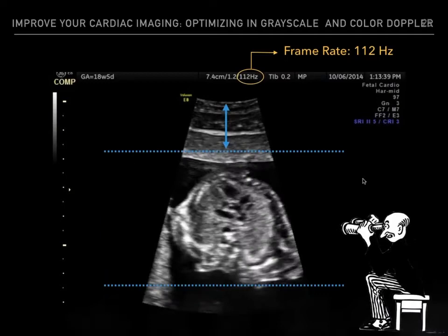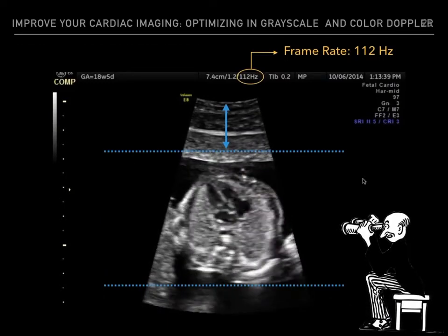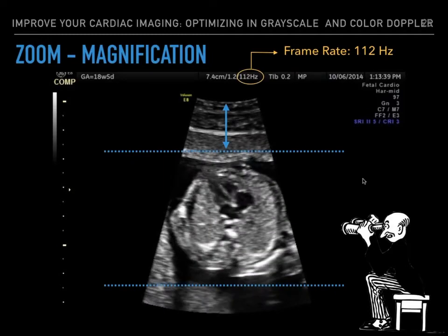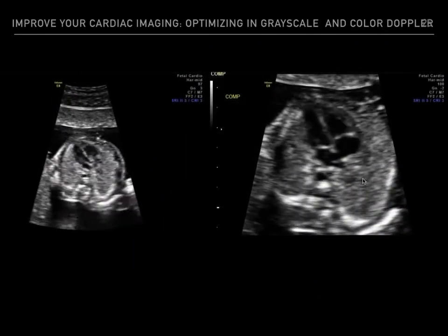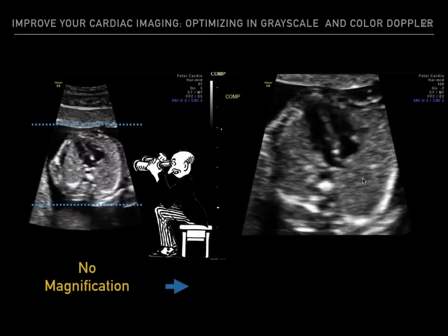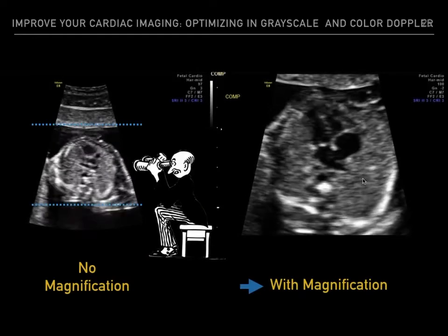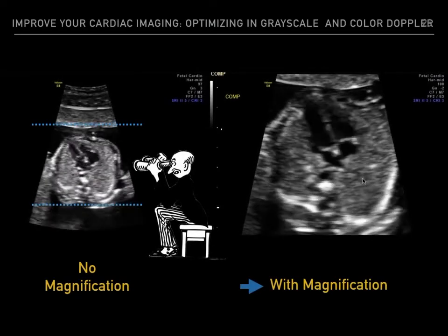Let's get rid of this extra near field space and magnify to our area of interest. This step is called zoom magnification. So you're coming from an image with no magnification to an improved image with magnification. In comparison with the two, we can clearly see which is the better image.